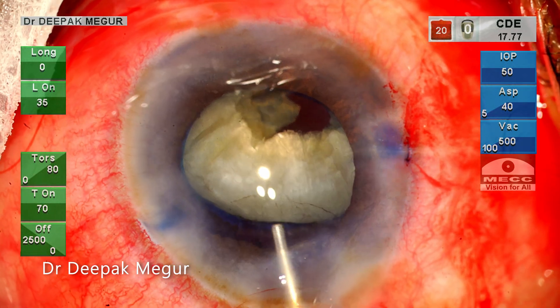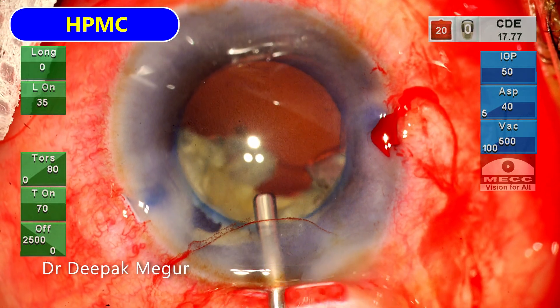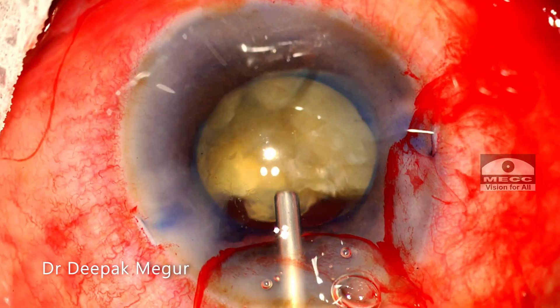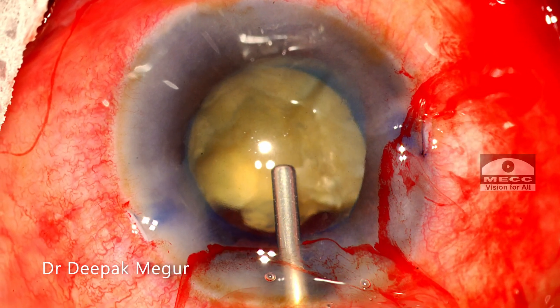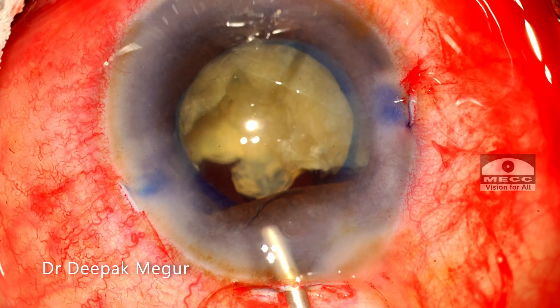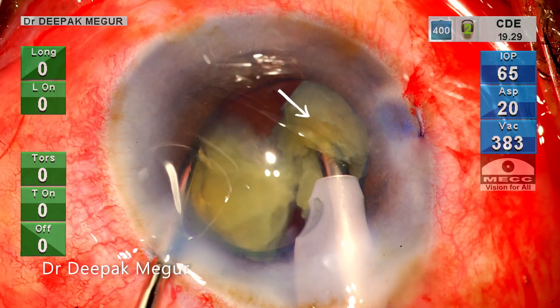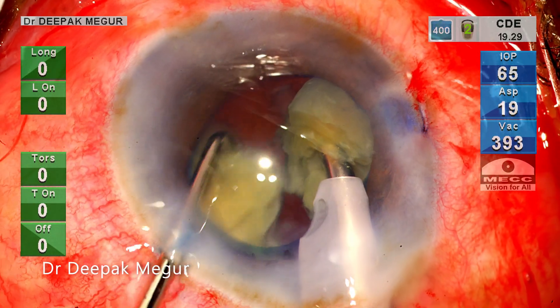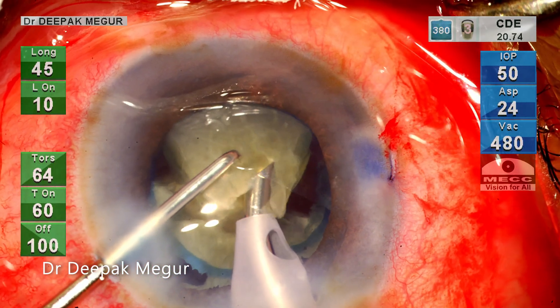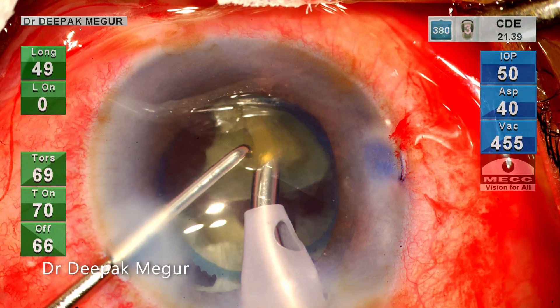Time to replenish the OVD. Dispersive OVD goes in first followed by HPMC. The flabby iris is trying to come out — it's gently repositioned back with the aid of OVD. The hemi-nucleus is divided and I need to emulsify this fragment now. I want to emulsify it at a posterior plane, at the level of the pupillary plane, so that I can protect the corneal endothelium which is already slightly compromised.